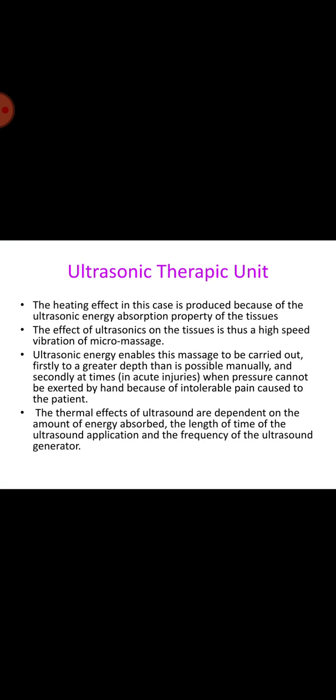Welcome to this module. In this module, I'm going to speak about the ultrasonic therapeutic unit. Ultrasonics are used for therapeutic purposes in the same manner as a shortwave diathermy machine is used.